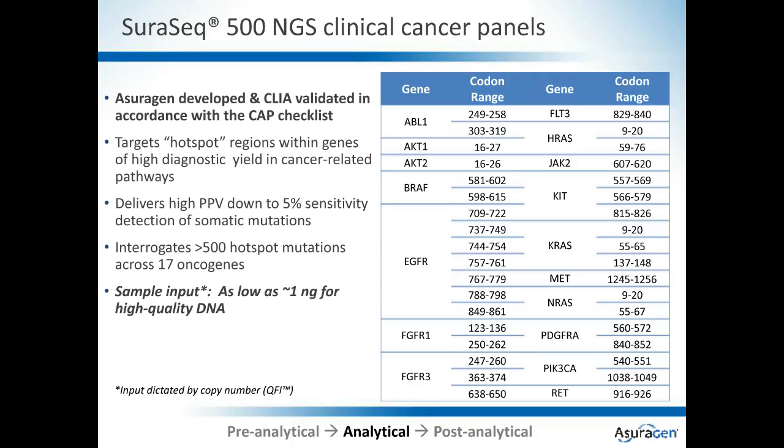One of these samples had a PIK3CA and a KRAS mutation. The other sample had a BRAF V600E mutation. And when we mix them at different levels, what we're able to show is that going down near the limit of analytical sensitivity, a theoretical 4.4% variant was detected at 6%. A 4.5% KRAS variant was detected at 4%. And in the converse titration, a BRAF at 4% was detected at 4.8%. So this is the relevant experiment because this is the exact clinical specimen that's being evaluated in the clinical context of how this NGS assay is implemented in our clinical lab.